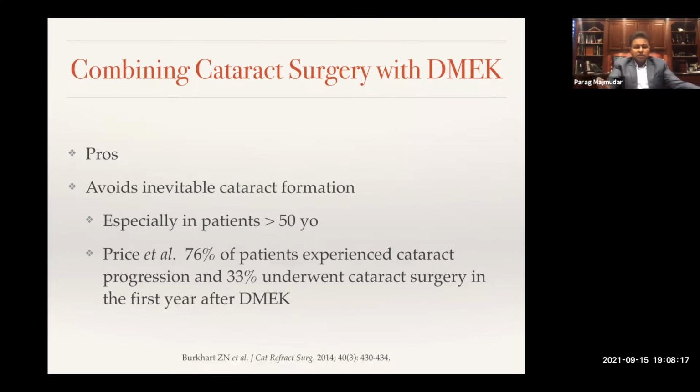There was another study where Price and his group found that 76% of patients had cataract progression, and 33% of those underwent cataract surgery within the first year after DMEK. So this is something that needs to be discussed with patients when you're sitting in the chair and saying, hey, look, you have no cataract, but we're going to do DMEK, and there's a good chance, I don't know if it's going to be a year or 2 or 3, but probably earlier than you would have otherwise needed, that you may need cataract surgery.